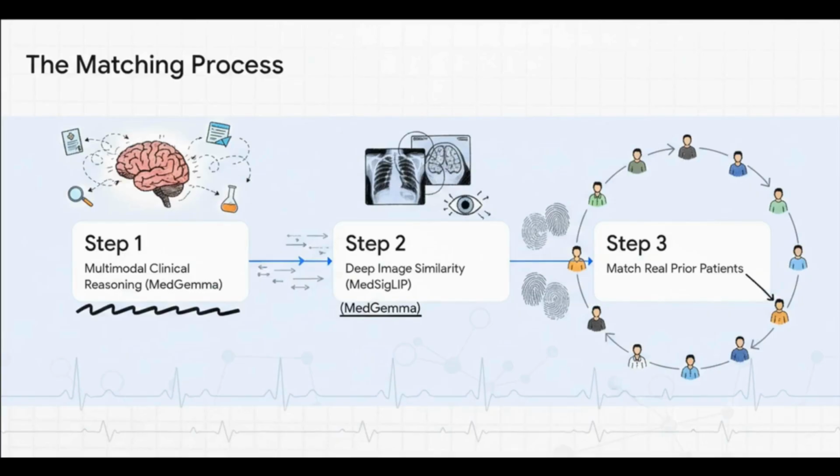Using MedGemma for multimodal clinical reasoning and MedSiglip for deep image similarity, it matches real prior patients to the current case, delivering fast, transparent, case-grounded insight beyond generalized guidelines.